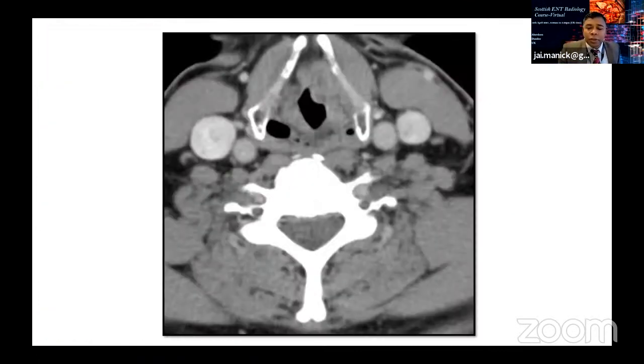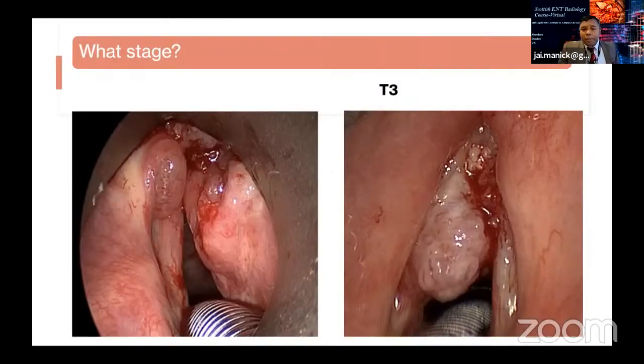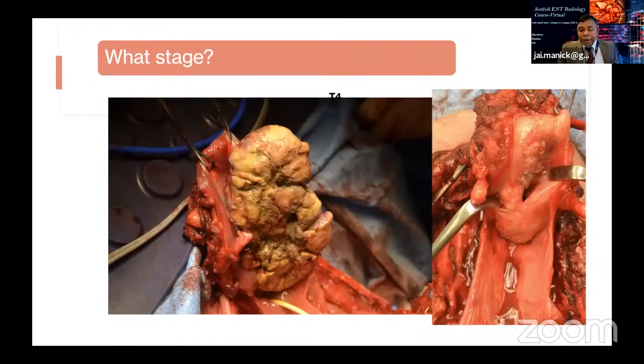So that's good. In this particular area, you can see there's a horseshoe-shaped tumor very close to the thyroid cartilage, but there's no breach, though it is involving the other side as well. This sort of tumor is T3, and definitely we will need a CT scan to rule out anything. This is T4, a very large tumor, or it can be a small tumor, still it can be T4.